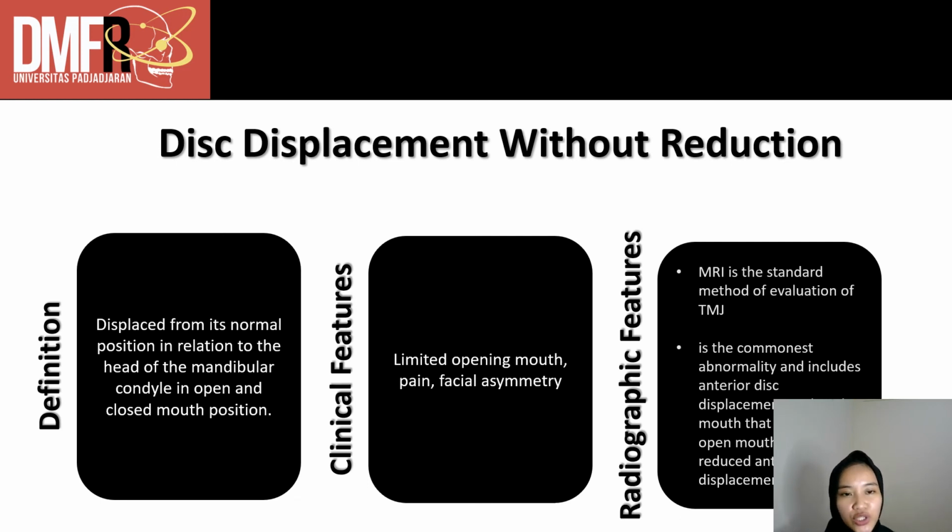The definition of this displacement is the movement of the disc from its normal position in relation to the head of the mandibular condyle in open and closed mouth position. The clinical features are limitation in mouth opening, pain, and facial asymmetry.